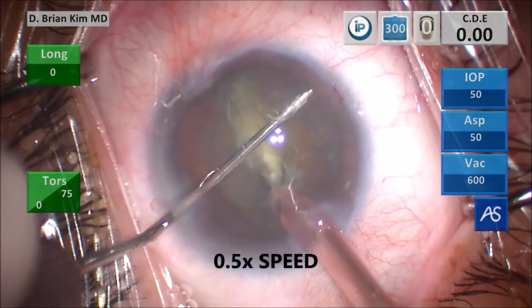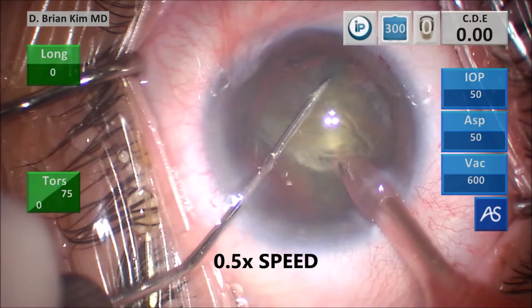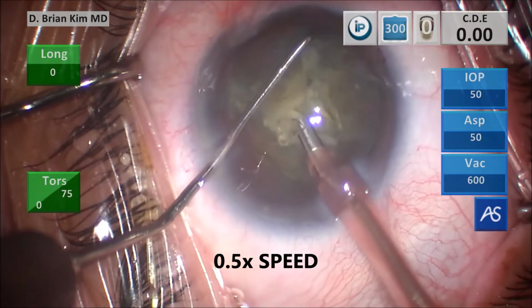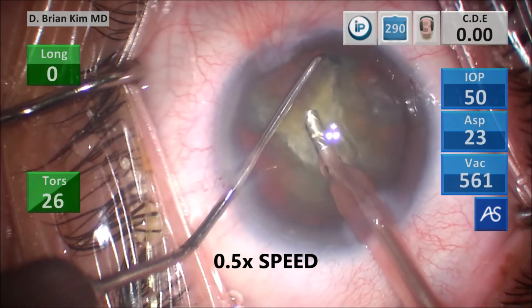Doing the same maneuver around the right heminucleus, hooking the peripheral lens, pulling it centrally toward the phaco tip, fracturing the lens against the phaco tip like you're fracturing against a cutting board or a chopping block, separating that right heminucleus in half, using some vacuum to lift that first quadrant up.